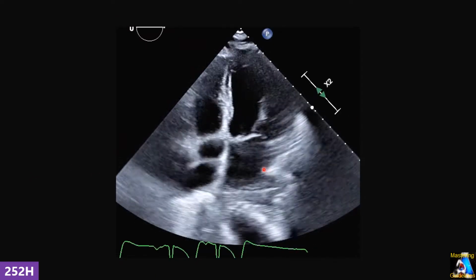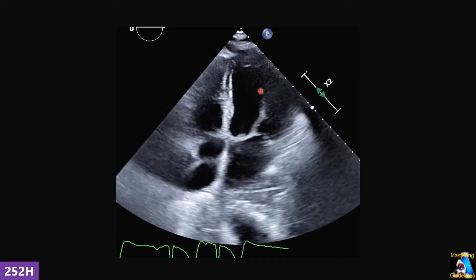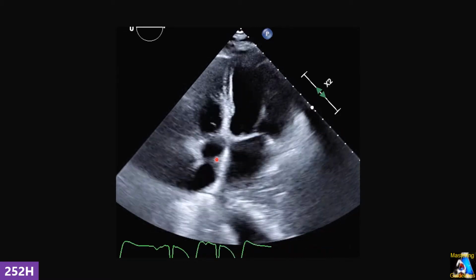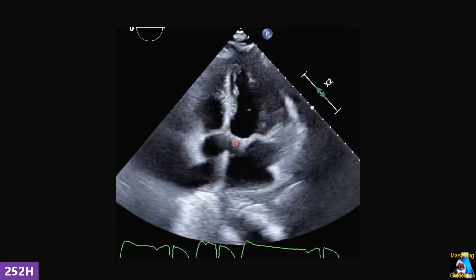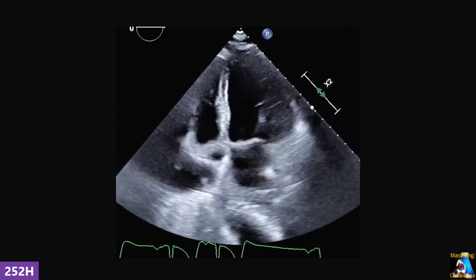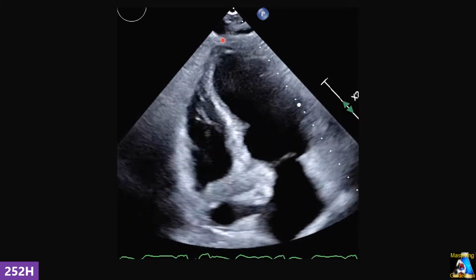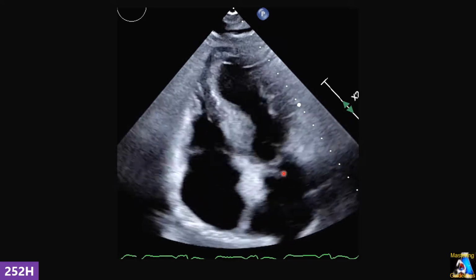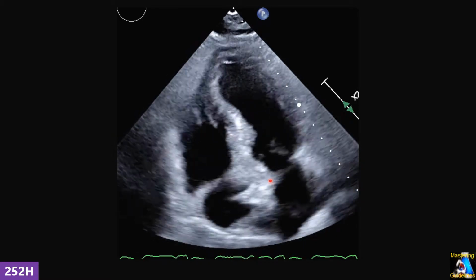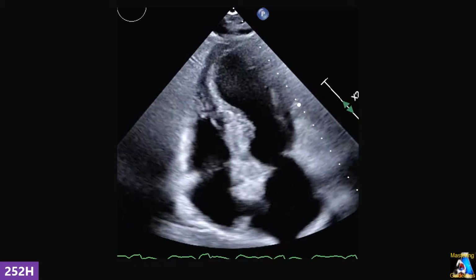You get the apical 4, you try, but it gives you this view. You can see we have a fair left ventricle size, everything, but the right ventricle is small, and even the right atrium is small. With which maneuver, only one maneuver, can we fix it and make it a good four-chamber view? Do this maneuver from apical 4, and it goes from here to like this. What maneuver has been done, what is this view's name, and why do we do this view?